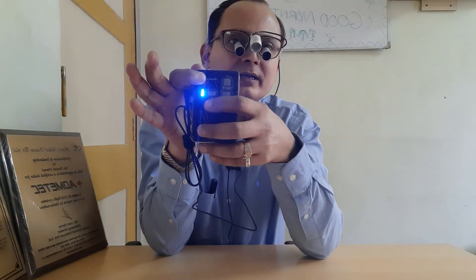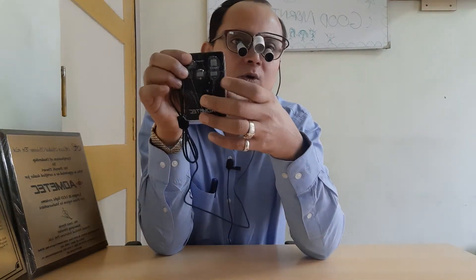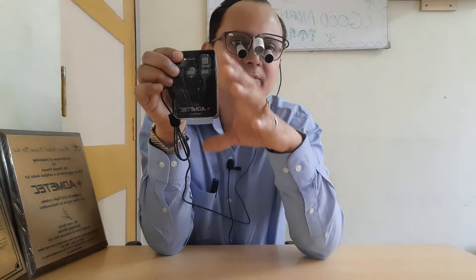If you look at the battery, this button also has an indicator. If you press this button, blue LEDs glow, and depending on how many LEDs are glowing, you will know the battery backup time left. The battery has an indicator facility which tells you how much of your battery is left.